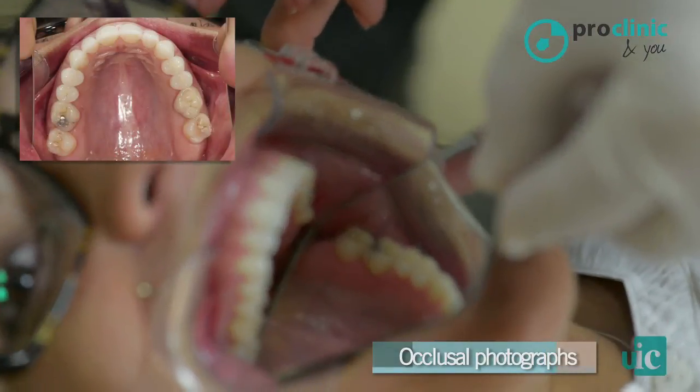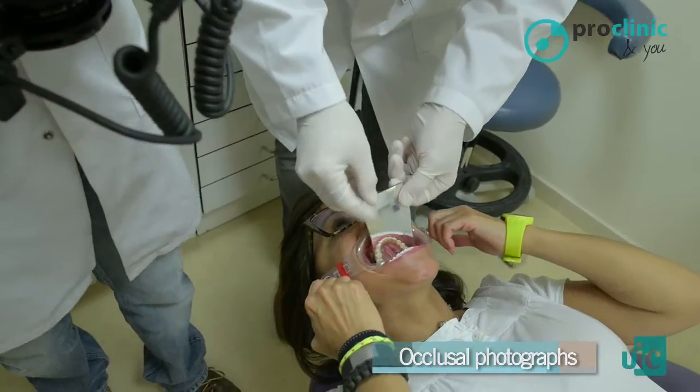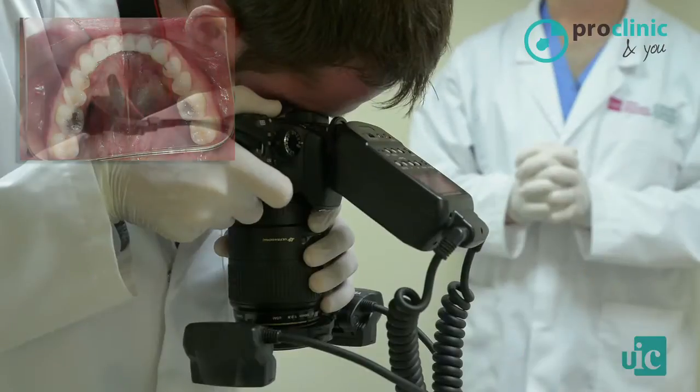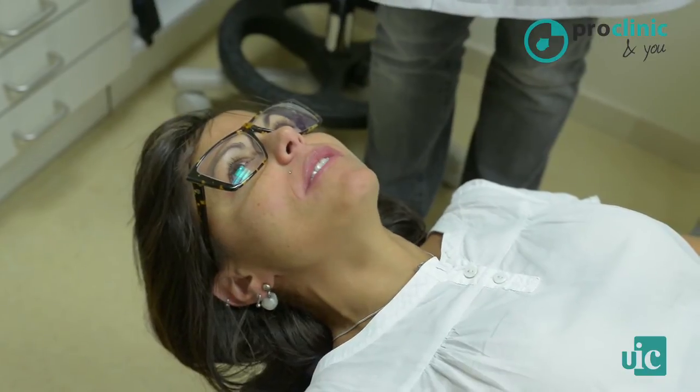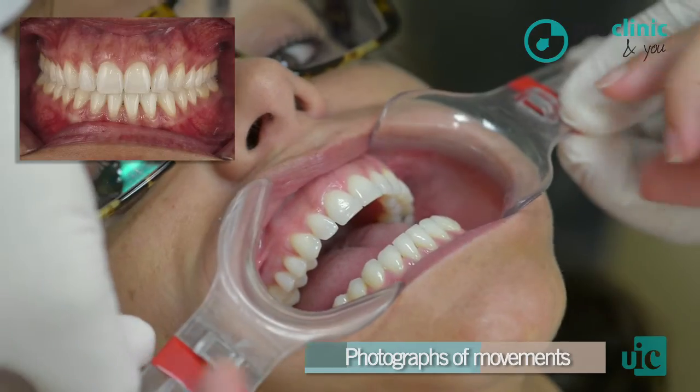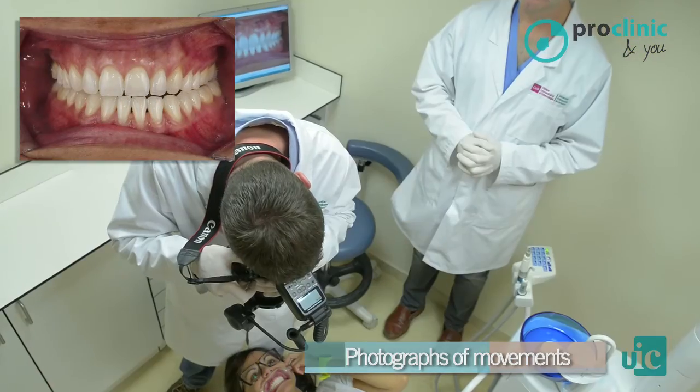Superior occlusal photograph and inferior occlusal photograph. Photographs of excursive movements, laterality, right and left, and protrusive.